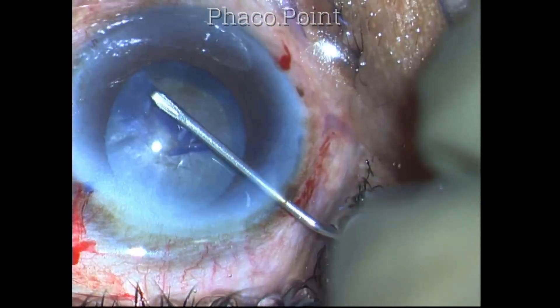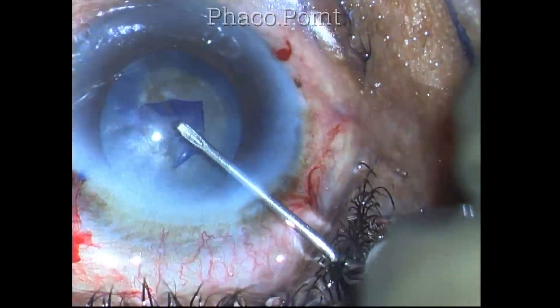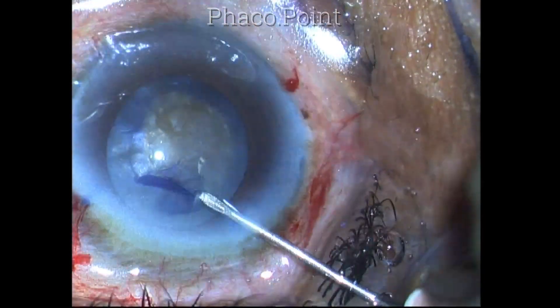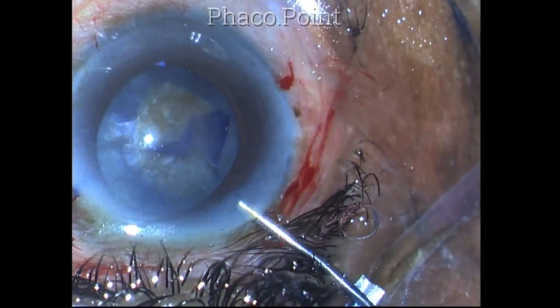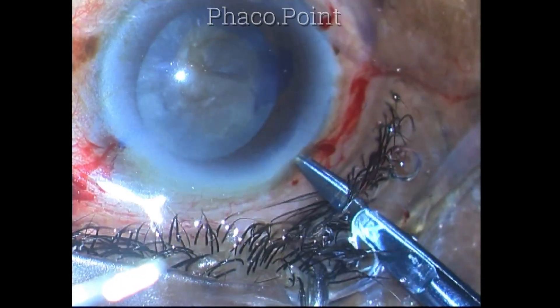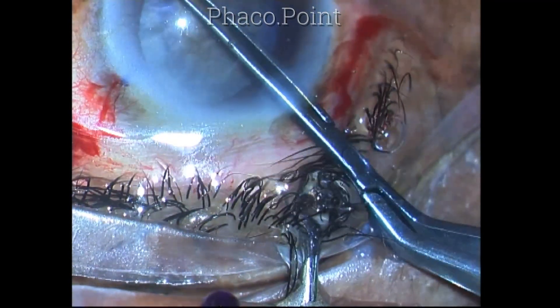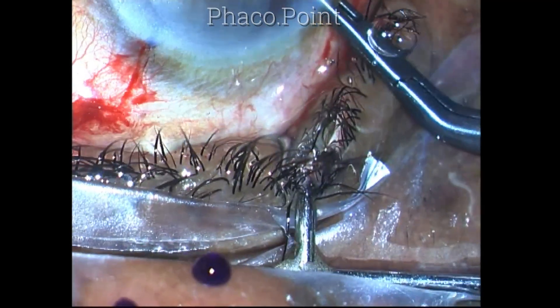The anterior capsular flap was quite easily manageable and a careful capsulorhexis is attempted. I'm trying to make a capsulorhexis opening of at least 5.5 millimeters or slightly larger. However, I end up with a much smaller capsulorhexis than intended, and therefore I decide to enlarge it by making a nick at the 5 o'clock position. Using the Innamura forceps, the capsulorhexis is enlarged slightly to give a rhexis size of about 5.5 millimeters.